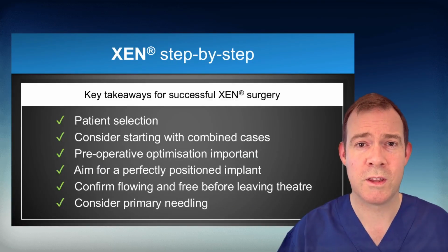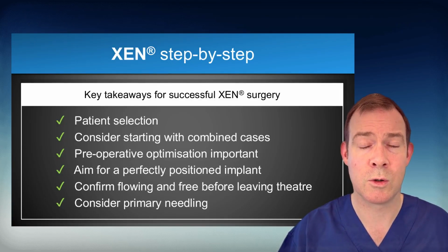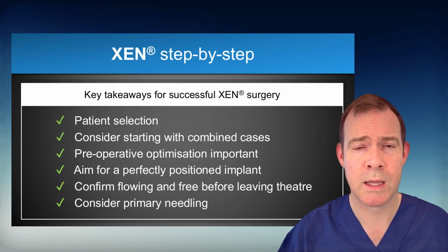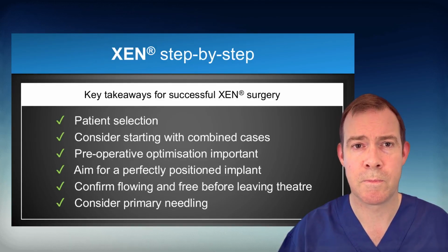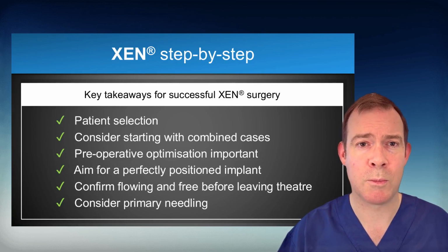So in summary, we've looked at the preoperative, intraoperative, and postoperative tips for successful ab interno XEN insertion. The key takeaways from this lecture are to look at patient selection carefully, to consider starting with combined cases, enabling you to simultaneously reduce intraocular pressure, medication burden, as well as providing visual rehabilitation. Preoperative optimization is important, and we want to aim for a perfectly positioned implant in every surgery.